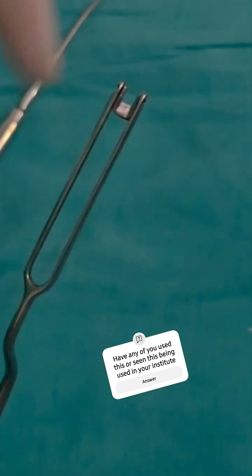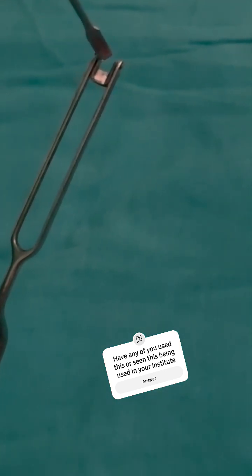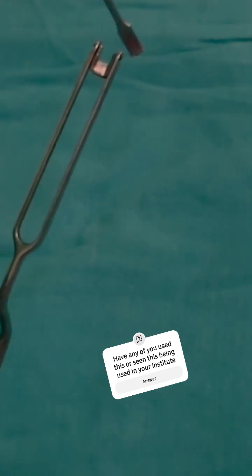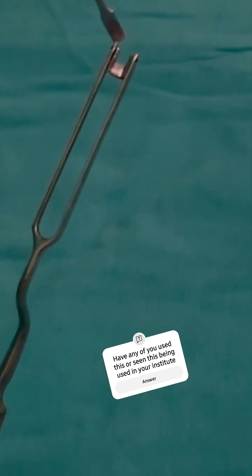The idea is that when we raise the mucoperichondrial flap, this blade will cut the cartilage and the prongs will prevent damage to the mucoperichondrium.